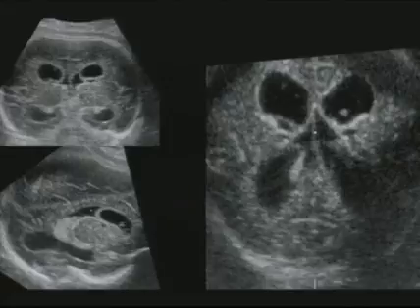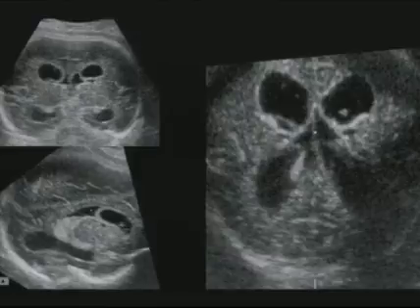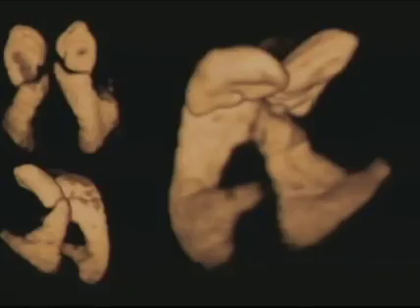But getting back to the fetus now, this is a fetus that has hydrocephalus. And it also has a funny cystic area right here in the frontal lobe and the frontal portion of the lateral ventricle. Now let's display that with inverse mode. And here we are. This is a cast of all of the fluid areas within the brain. And you can see the lateral ventricles, the entire lateral ventricles, as well as those cystic components in the frontal area.